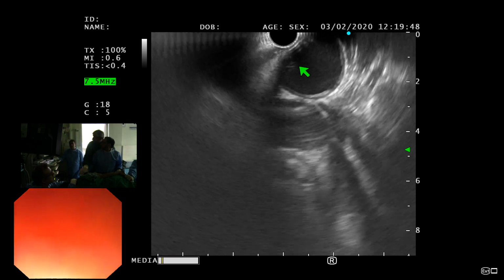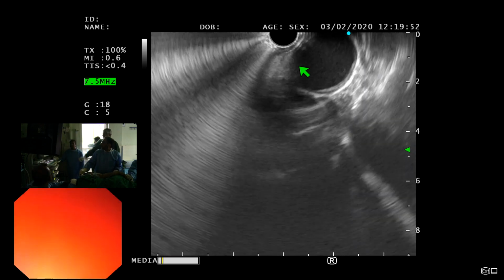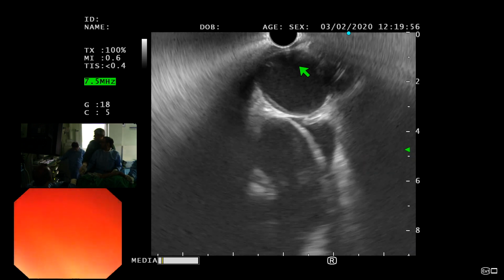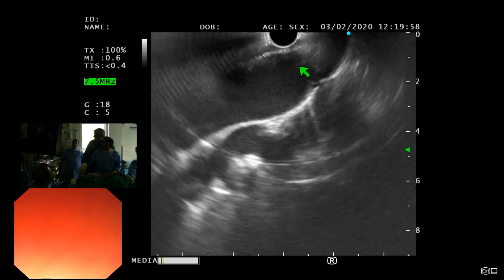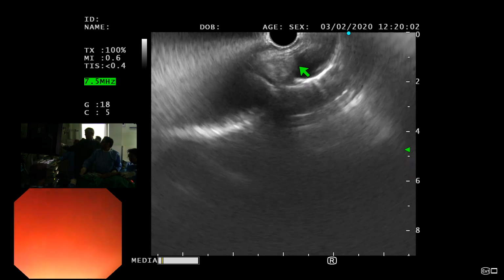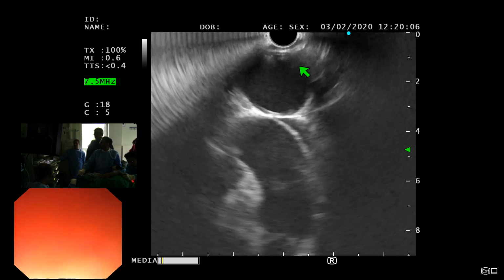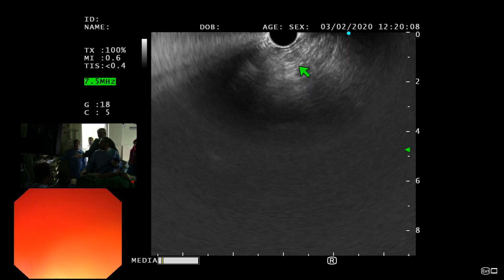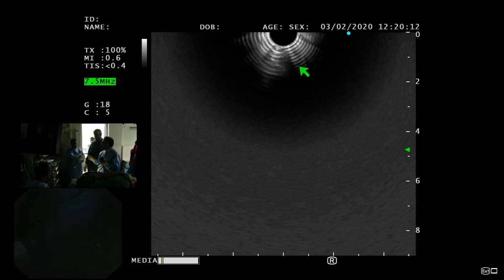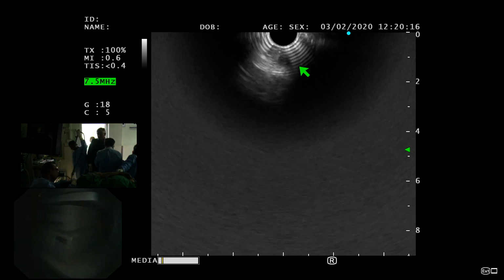That is just about where your AP window is. You see there it's separating, you saw it here. There, that's your aorta, that's your pulmonary artery, this should be the AP window. So I think this is the easiest way that Khalid teaches, but AP window is really neither here nor there for me. I'm not sure.